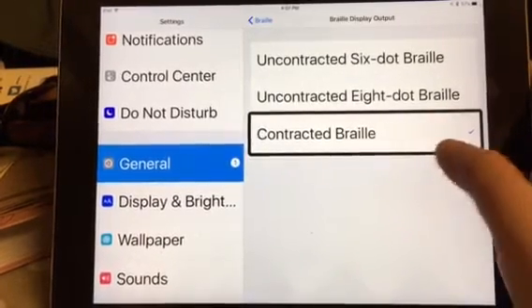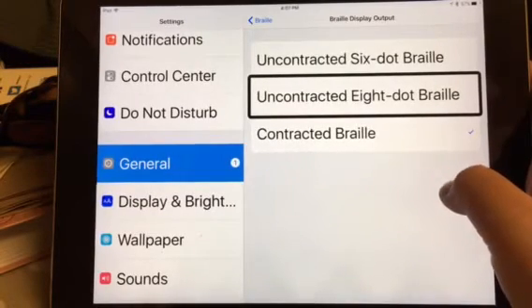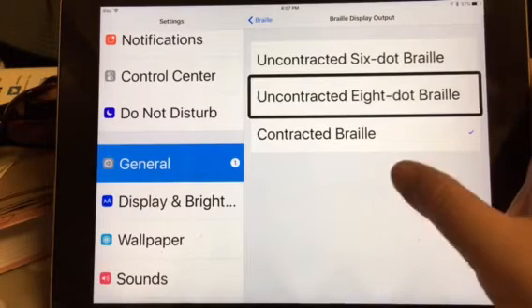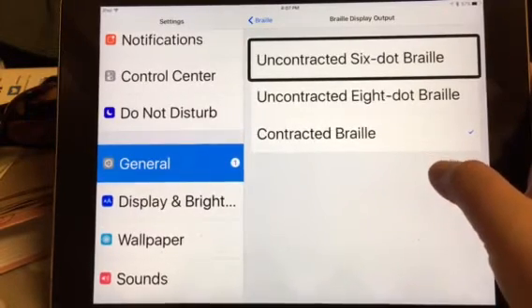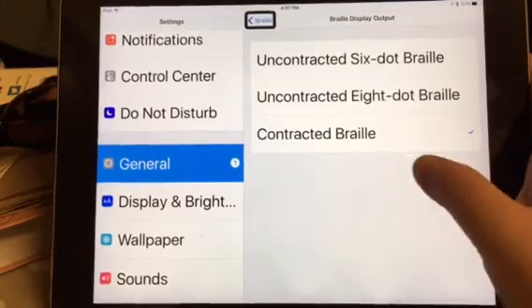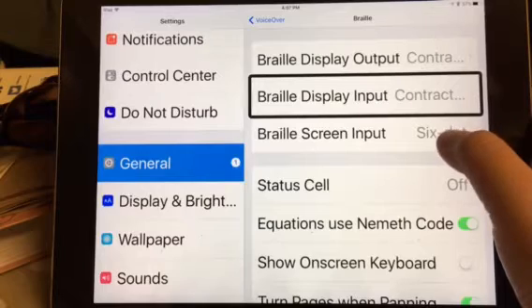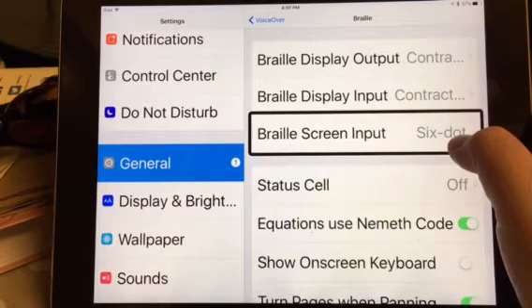Those are the three options you have, depending on what your level of Braille proficiency is — that depends on what setting you want it to be on. To select it, you just double tap. You can do the same for the Braille display input and the Braille screen input.